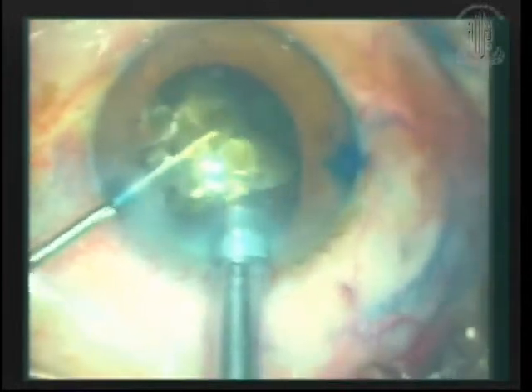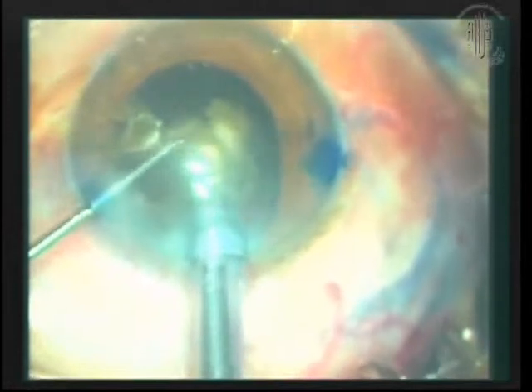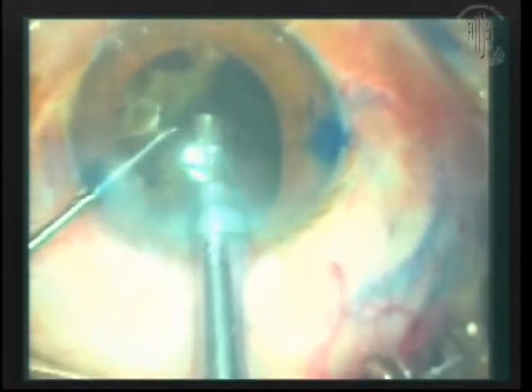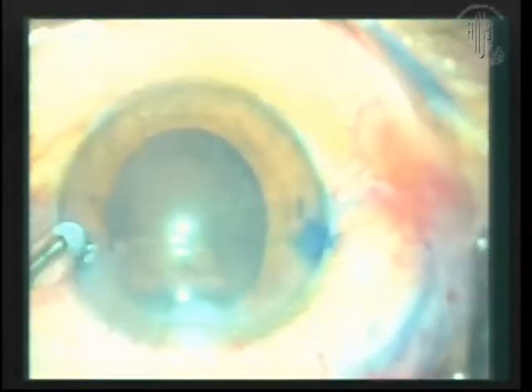It's turned white, milky white. I had very little choice. Now that I've created the wound burn, there is no backing off. I have to complete this case anyway. So I didn't want to bail out yet. So we go ahead and complete. It's a heroic surgery, no doubt. But let's look at the wound burn. It's a fish mouth thing. It's horrible.